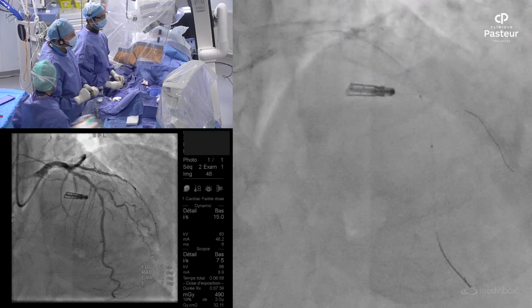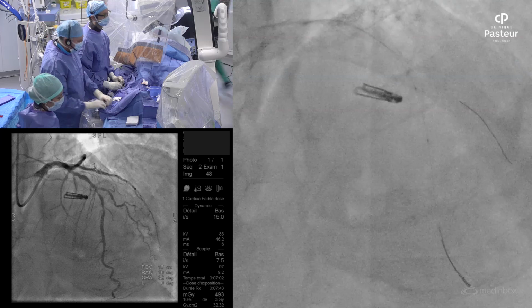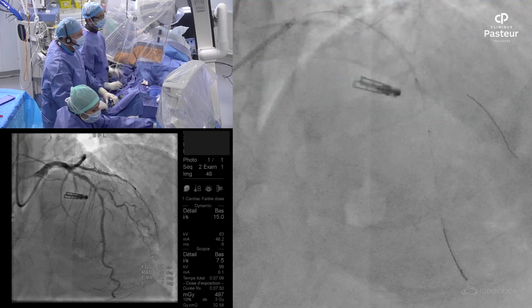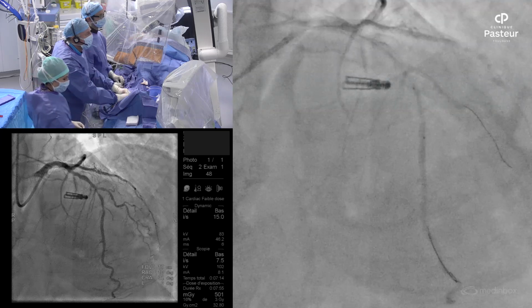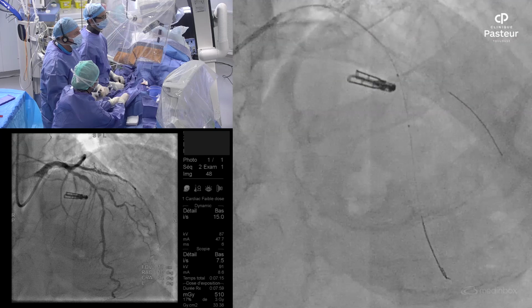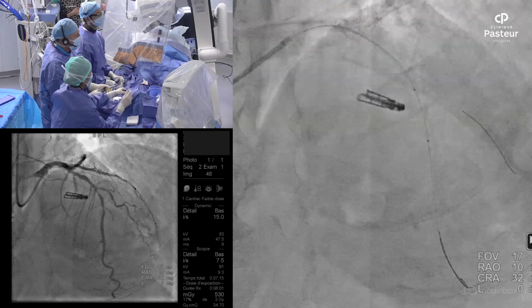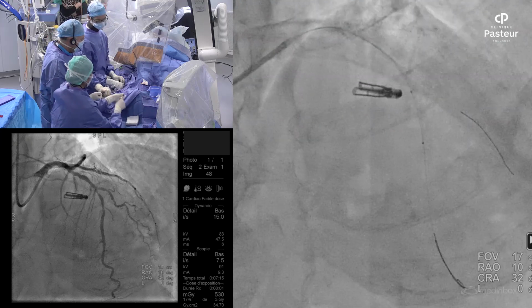This is an important issue. I think that with the availability of Shockwave, you really don't need a 2.0 burr, because that means the lumen of your artery is huge, more than a millimeter and a half. We use the 2.0 burr to treat left main or huge vessels. But now, if you have such a large lumen, you can go with a Shockwave balloon. The Shockwave will never cross a very tight lesion. This is why you need the rota before. You need a 1.5 rota.